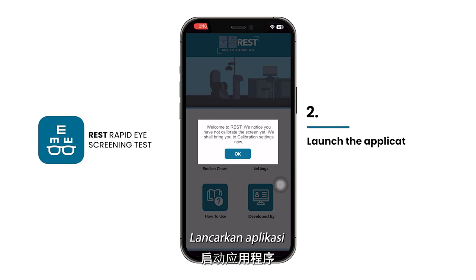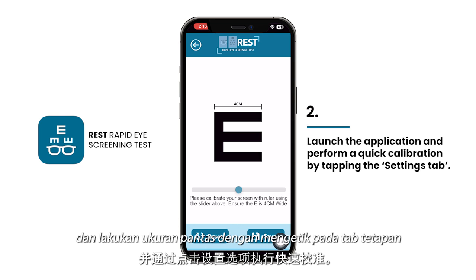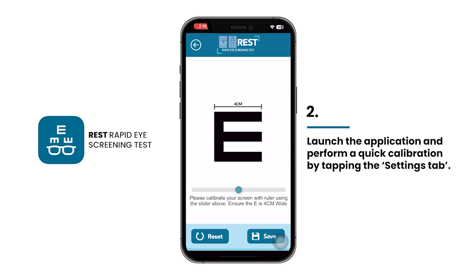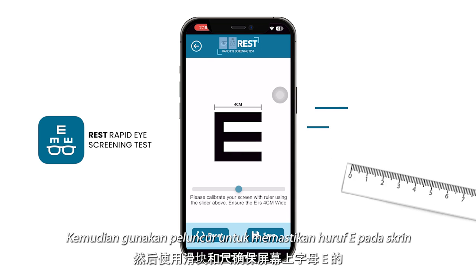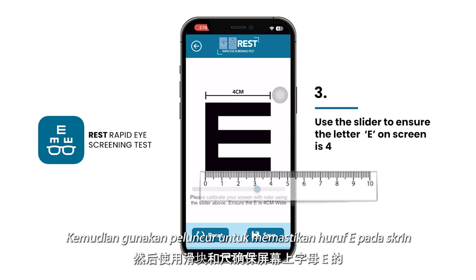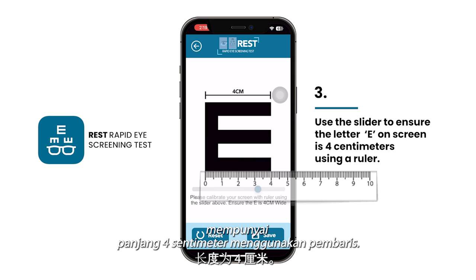Launch the application and perform a quick calibration by tapping on the settings tab. Then use the slider to ensure that the letter E on screen has a length of 4 cm using a ruler.